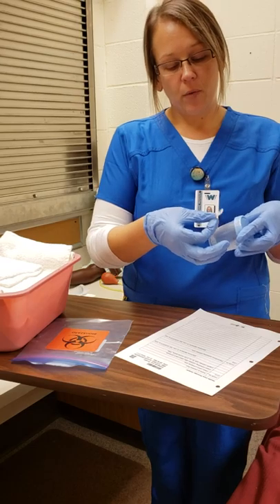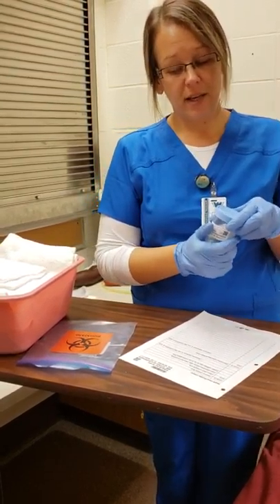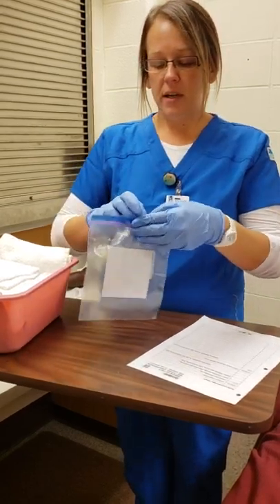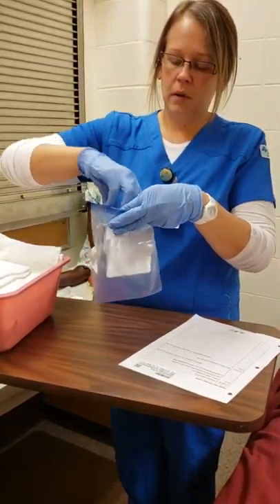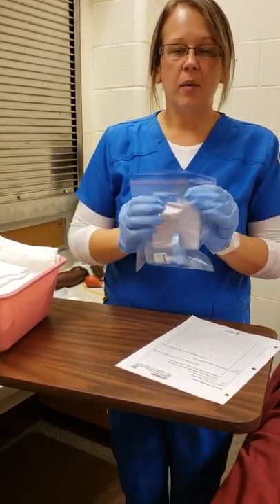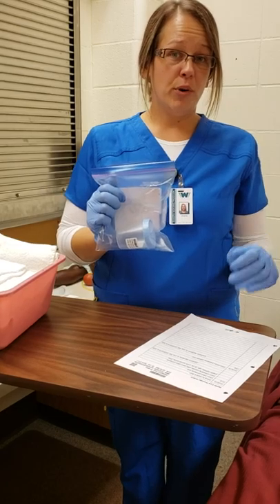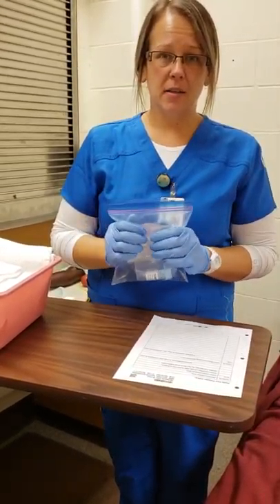Shirley just gave me this specimen and I'm going to label it with the date: 10-30-19, time 10:25, and my initials. I'll label that right on the cup making sure not to put it on the lid so it doesn't get lost. Then we're going to put this in our biohazard bag, zip it up, and delegate this to my helper to get it directly down to the lab so it would not expire as my specimen.